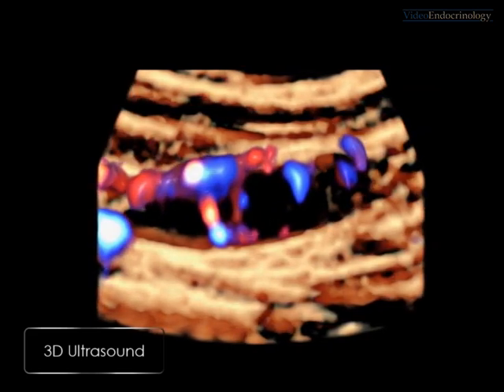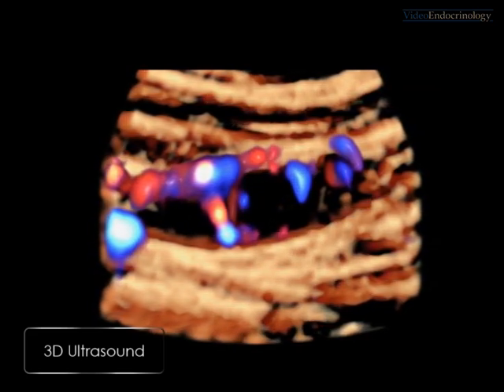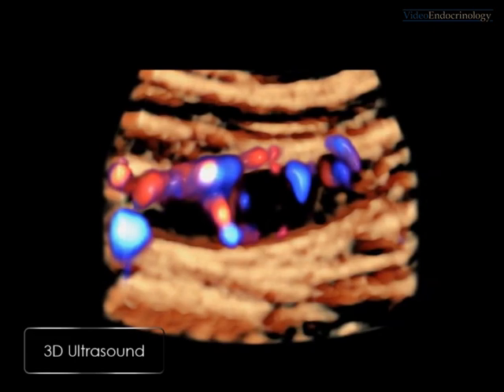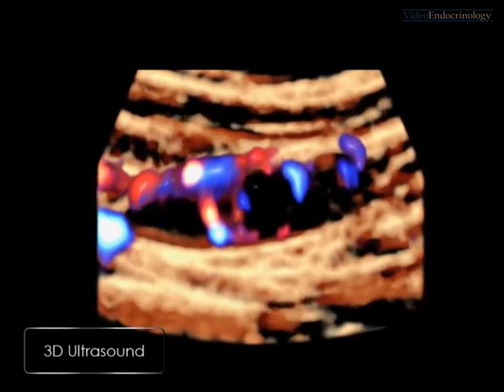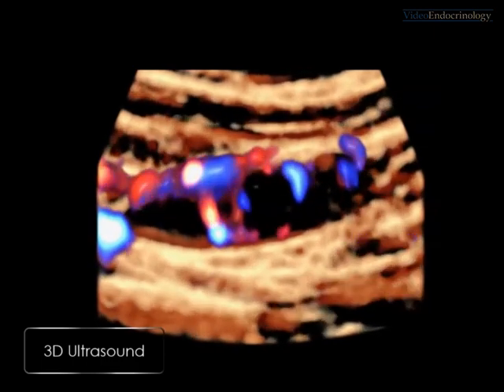Here is a rendered 3D image of the parathyroid adenoma. This is a 3D color Doppler showing a prominent polar artery.